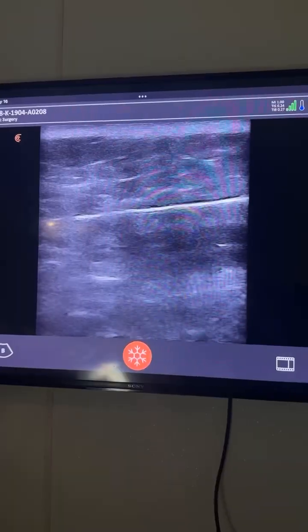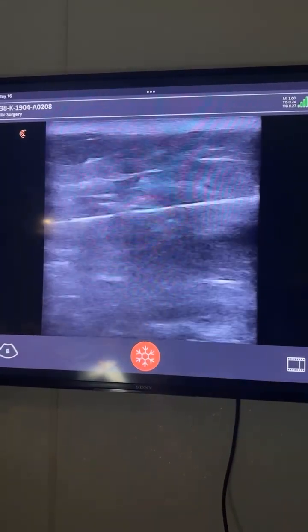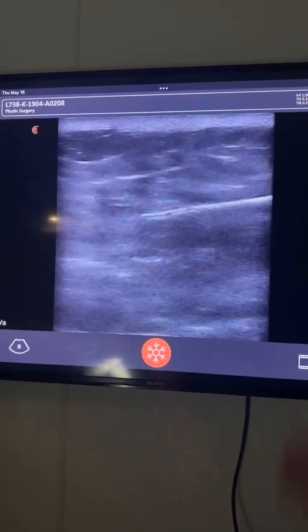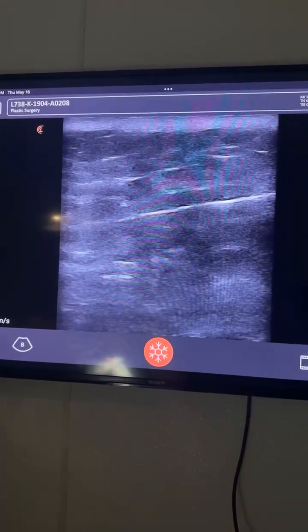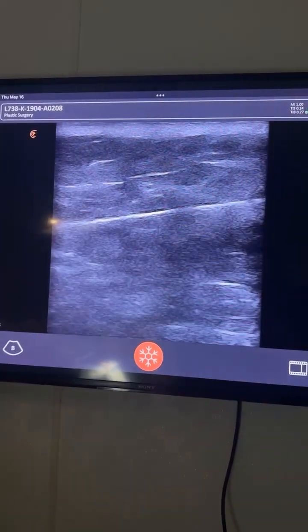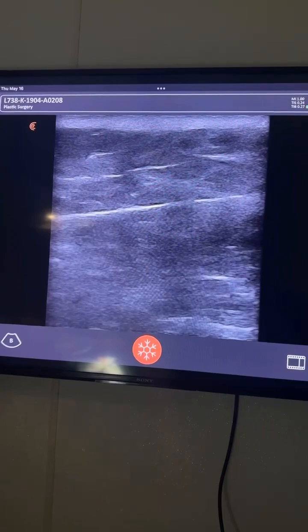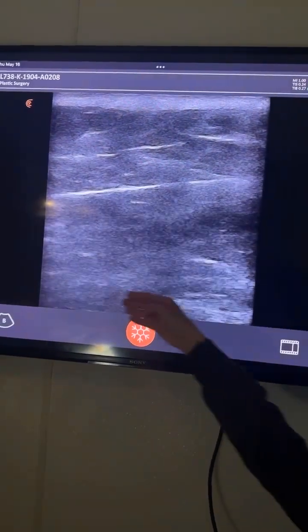Thank you. Okay, so you can see the cannula here. I'm going to wiggle it a little bit, right? You can show it to them. Right there is the cannula. Very good. And show them the superficial gluteal fascia. That is right here. Okay, and the deep gluteal fascia. That would be right here. And the striated muscle. It is this down here below it.